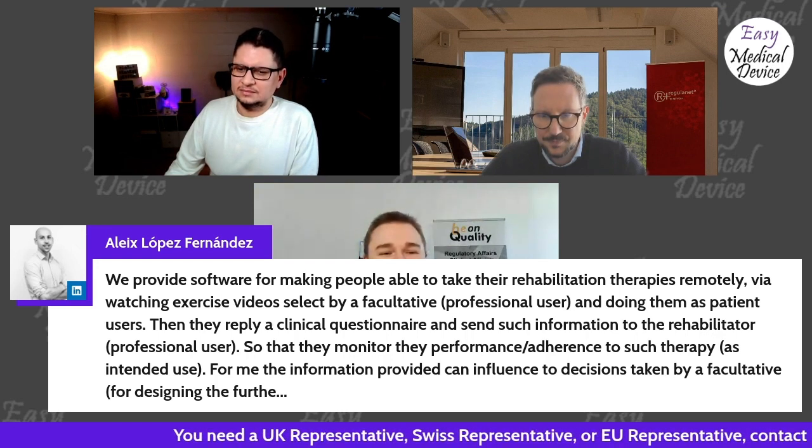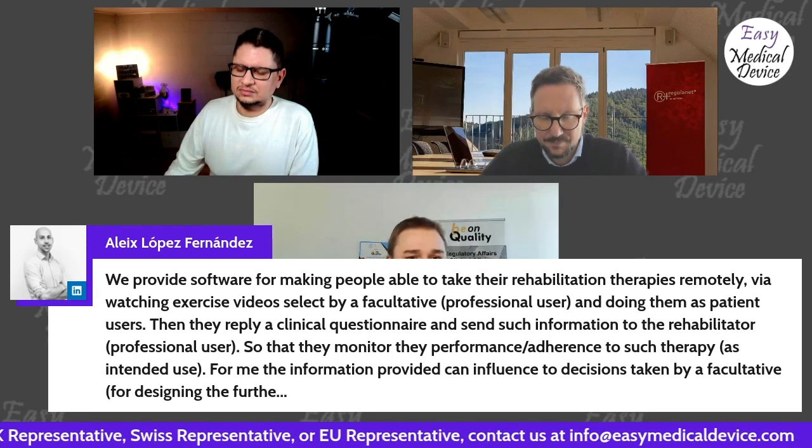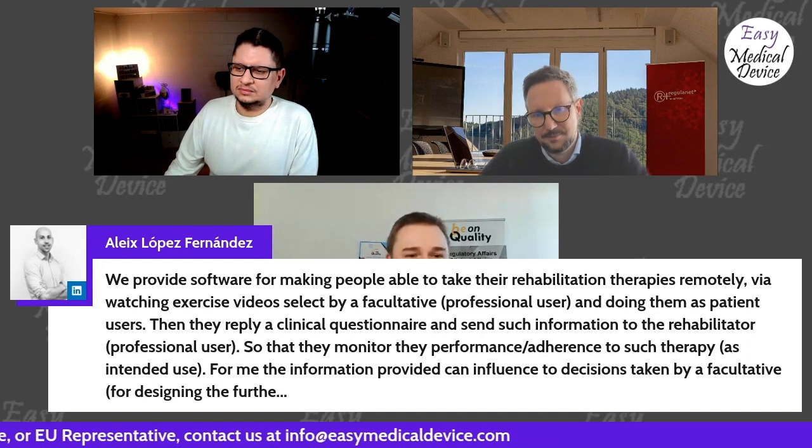As soon as you start automating that and calculating it, trending that kind of scores, then it becomes a medical device, and then it's a physician's tracking.